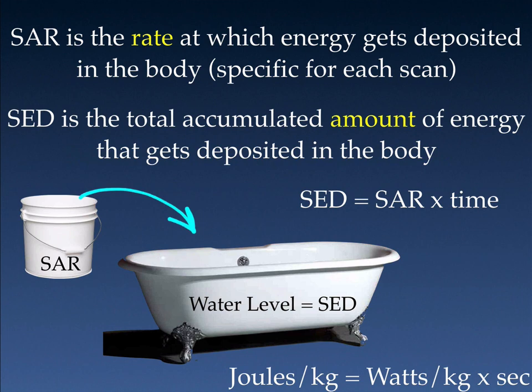SED is the total accumulated amount of energy that gets deposited into the body. So you can think of SED as equaling SAR times time. One of the good examples that I've seen of this in the past uses the illustration of a bucket of water and a tub.